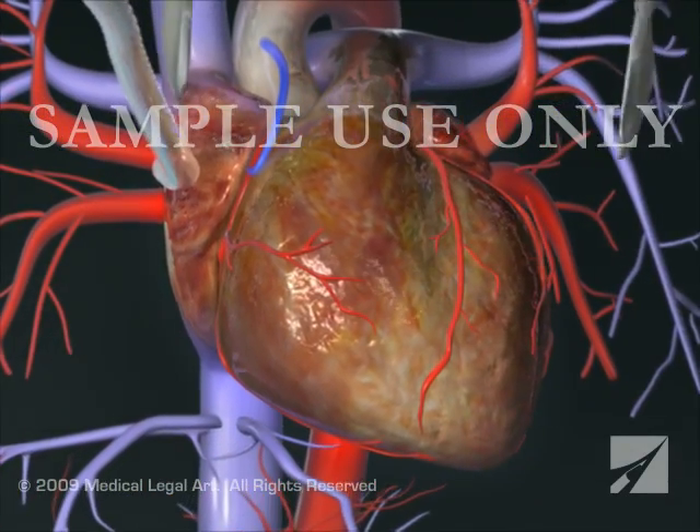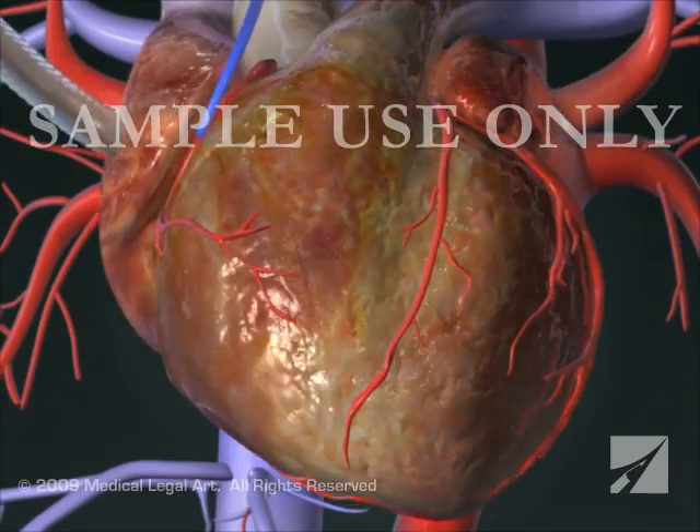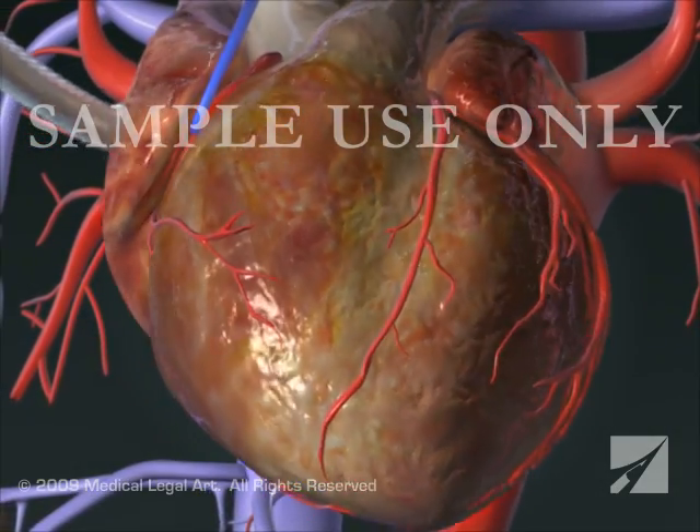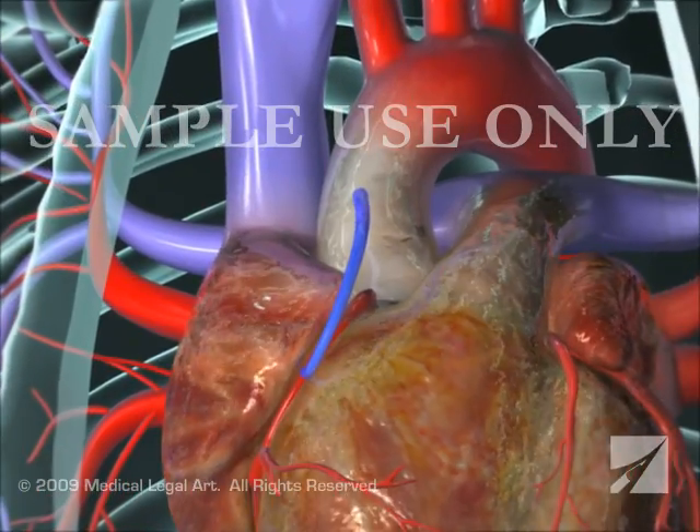your surgeon will use electrical signals to restore the heartbeat and attach a temporary pacemaker to the heart. Once your heart is again beating normally, the heart-lung machine will be disconnected.